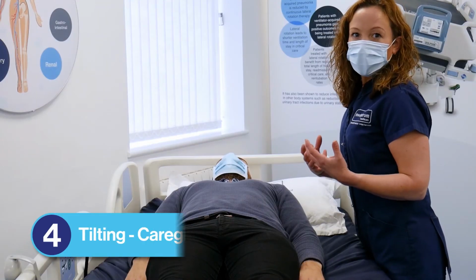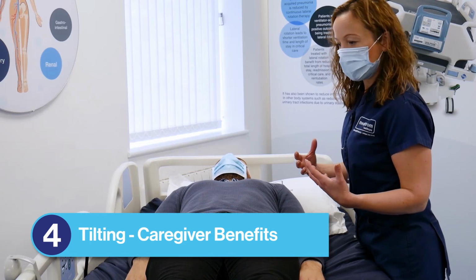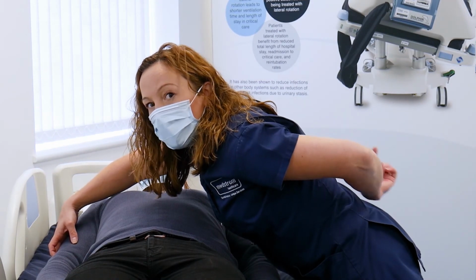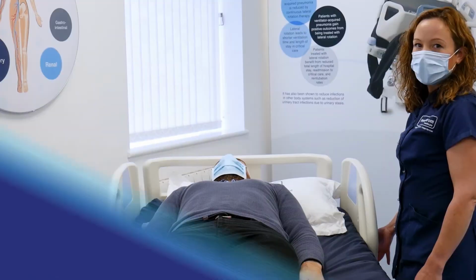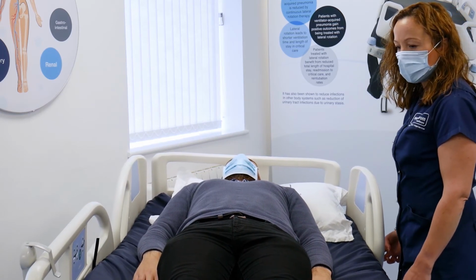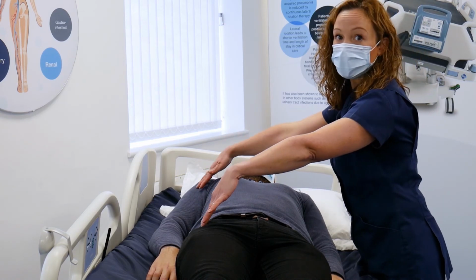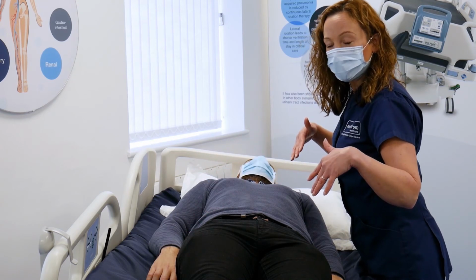The benefit for the caregiver of using a lateral tilt can be shown by this demonstration. If I'm going to reposition my patient, you can see by the angle of my back that I'm going to be using my back and my arms to complete this maneuver. If I put the patient into a tilt towards me, you can see that instantly my back is in a much more aligned position and the tilt will make it easier to move the patient towards me.